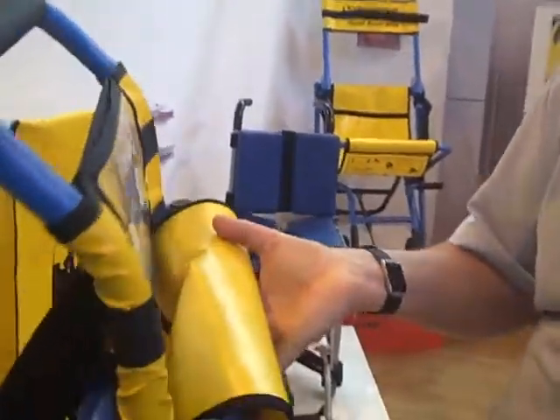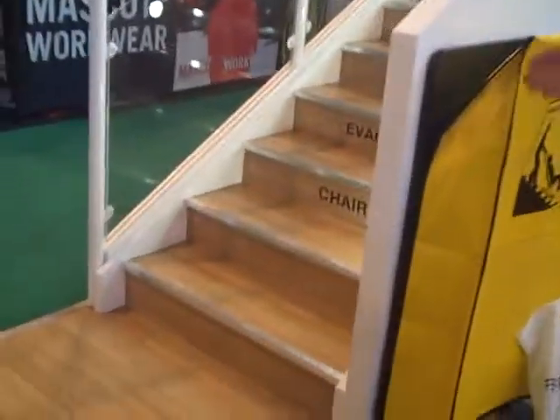The chair weighs just under 10 kilos, very light in weight, very versatile, and can be used on most types of stairways, including concrete, metal, and plastic stairs. And as you can see here, we have metal edges.